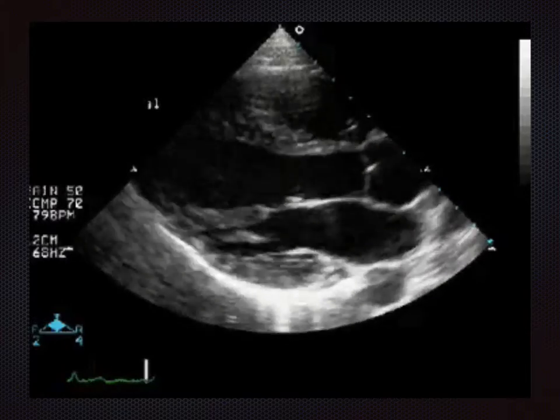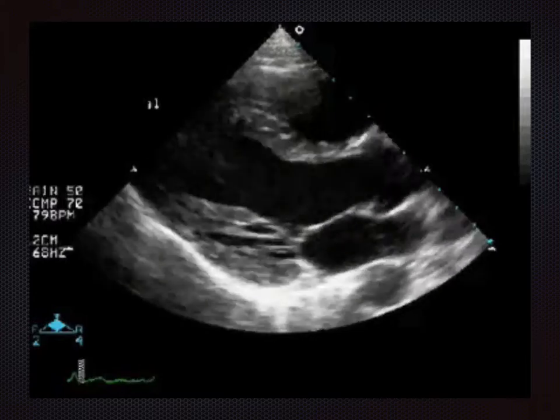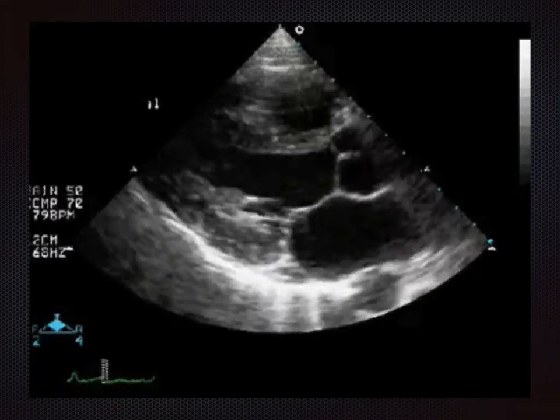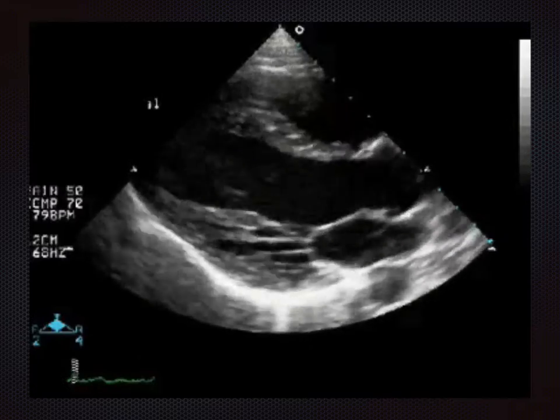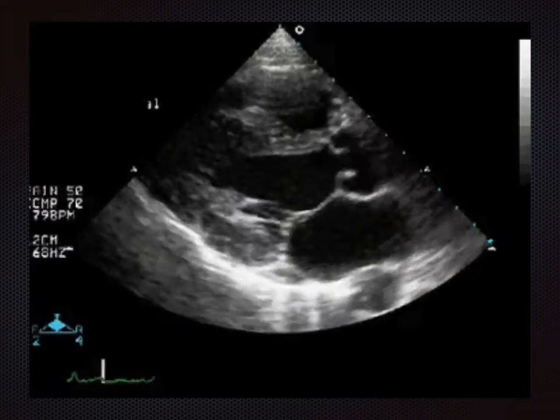It ranges between about 9 and 12 millimeters, but a centimetre is a good rule of thumb. And remember, we can estimate what a centimetre looks like by looking at the markings on the scale on the right of the sector image.